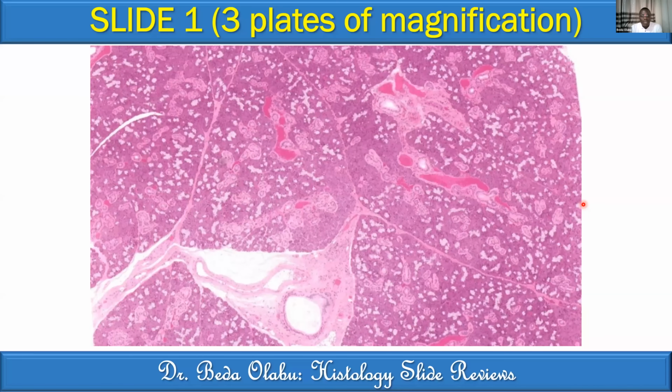So the lowest magnification is this one. I'm giving you 30 seconds to look at it. If you're able to scribble something on your end, not on the chat, just on your end, just pinpoint some things. I'm hoping you have a book and a pen and you're seated on a table, you're not on a matatu going somewhere. So you're able to write down some things so that we have a checklist. Then you're able to evaluate yourself on how you're doing between 0 to 10. You can grade yourself.